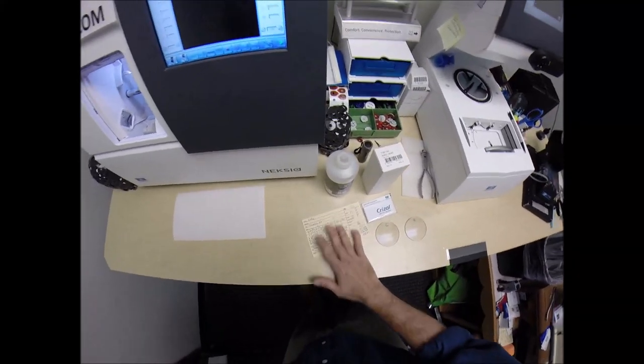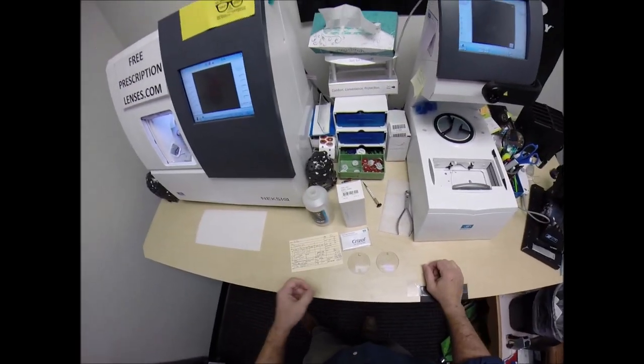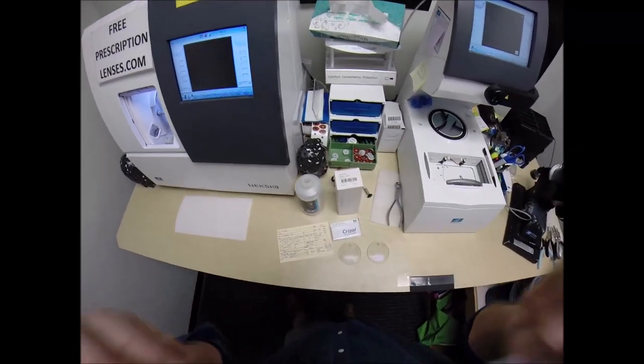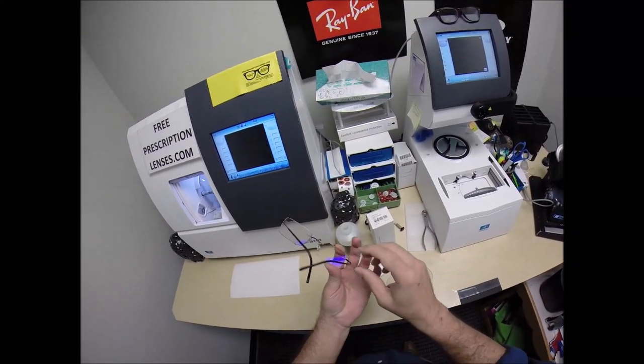Here's a good teaching moment. Kelly saw some of my previous videos and my social media pics where I've taken pictures of Silhouette frames. When I say Silhouette, they are the drill mount frames where you literally drill holes in the lens to mount them.